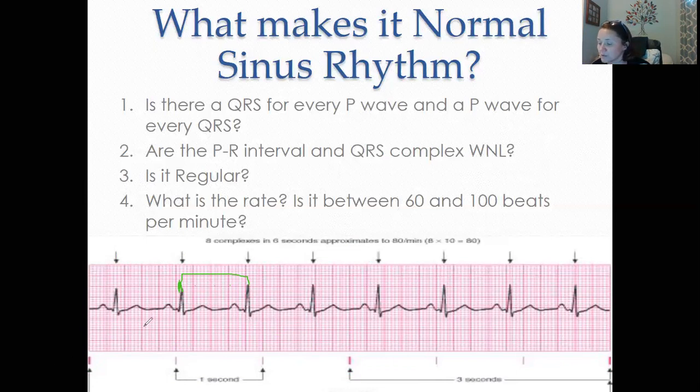The other thing you can do is count out the small boxes. For instance, here, remember we can count by 5. So we've got 5, 10, 15, 16, 17, 18, 19, 20, well, 5, 10, 15, we had like 19 because we were pretty close.